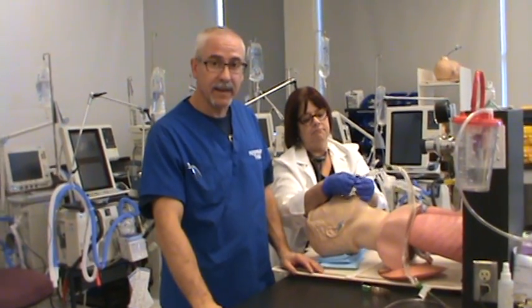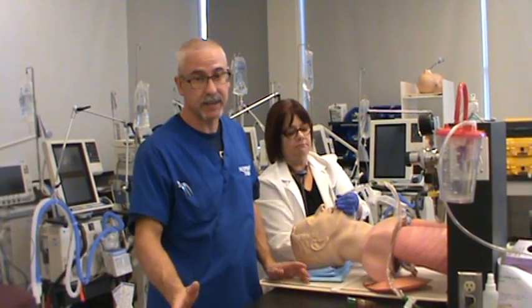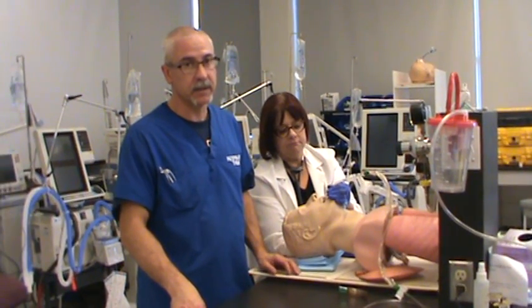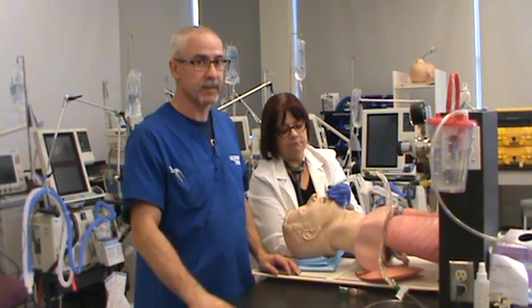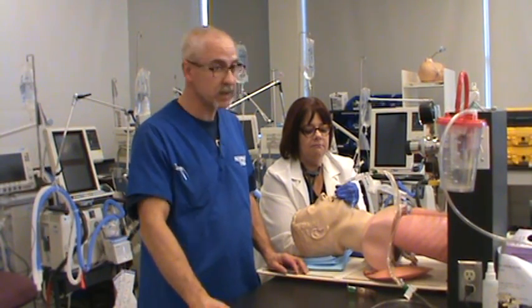Welcome back. This is the seventh in the series of videos showing you how to intubate a patient. In this one, what we're going to be doing is focusing on securing the tube once it's been placed in the patient's trachea and confirmed to be there. So it's the taping process.